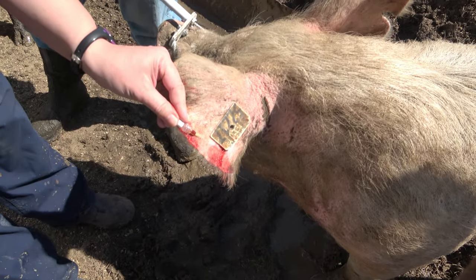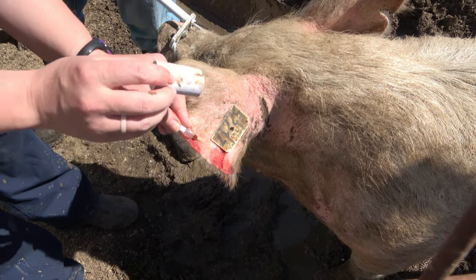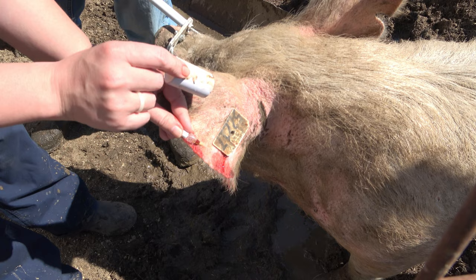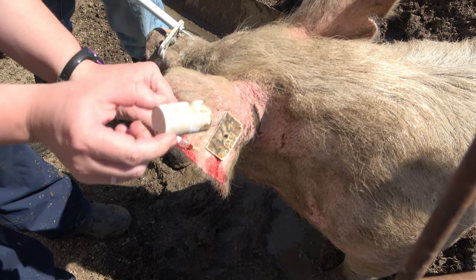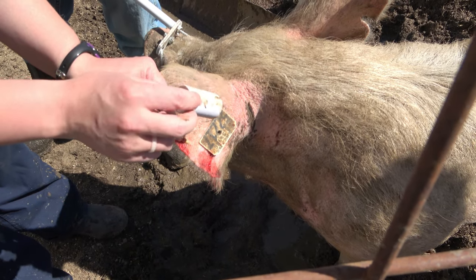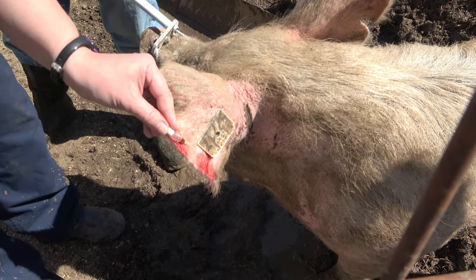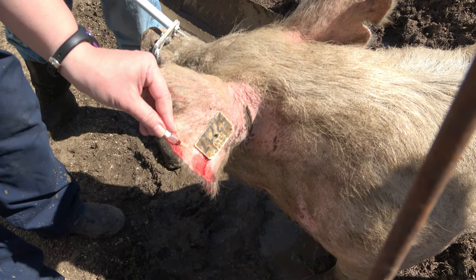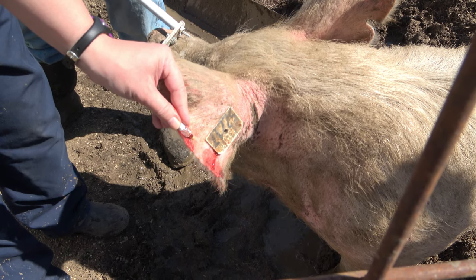A trick I wanted to tell you guys about today is I really like to use the center of the 2-inch vet wraps to place inside the pig's ear to kind of round it out and make it easier for your taping. This sow's ear is way too big for that, but for your smaller pet pigs, this is definitely a great trick to make your taping go a lot smoother for you. So what we're gonna do now is go ahead and tape this catheter into the sow's ear. What I like to do is take a skinny piece of tape.